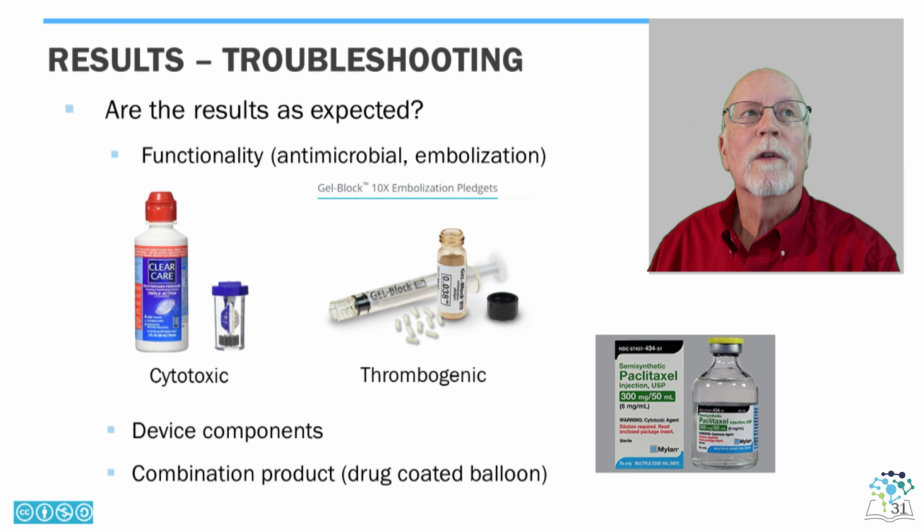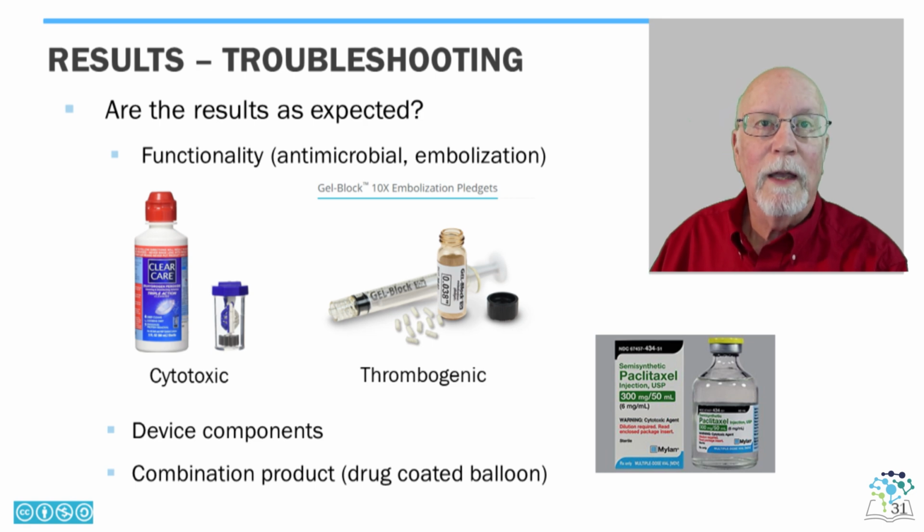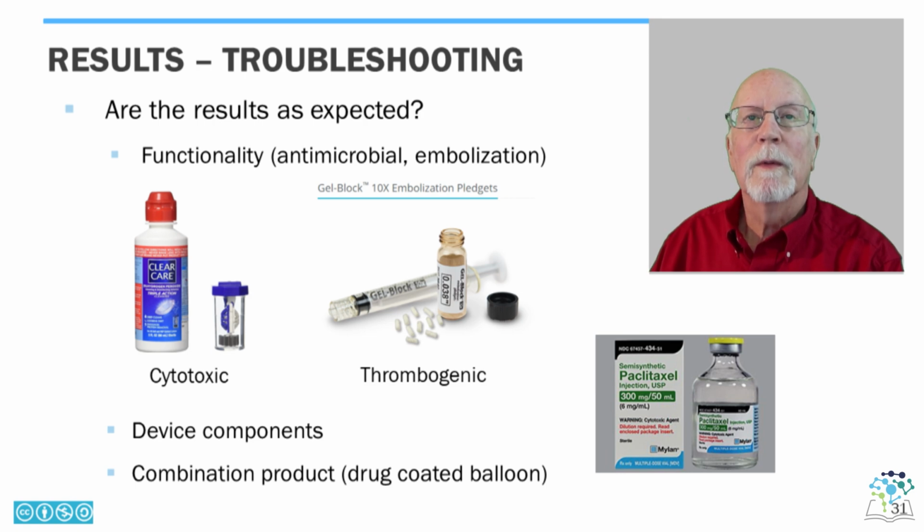Glutaraldehyde is often used to sterilize and preserve biological materials in devices. However, no matter how well a device is rinsed, per stipulations in the IFU or instructions for use, extracts from glutaraldehyde-treated materials will always fail a cytotoxicity test. These failed tests need to be justified, and this is a good example that most always meets with the reviewer's approval.